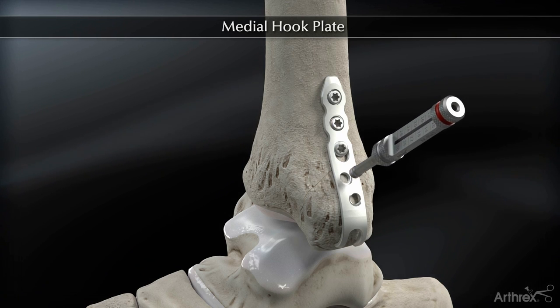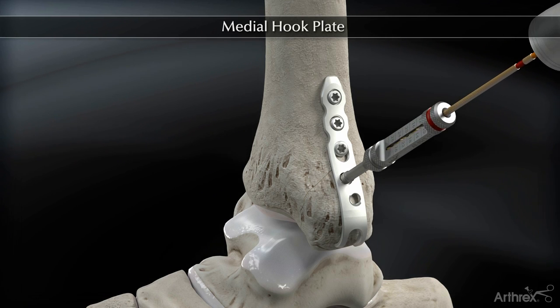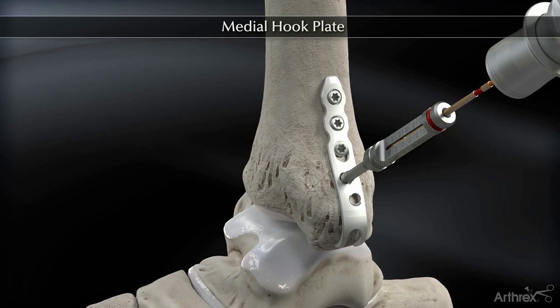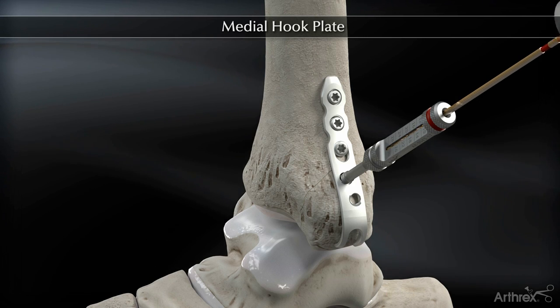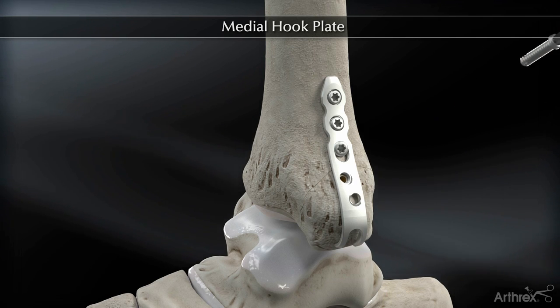The drill guide, drill bit, and screwdriver are color-coded for these screws. Distally, the surgeon has the option of placing either a 2.7 millimeter locking screw or a 3.0 millimeter cancellous screw.